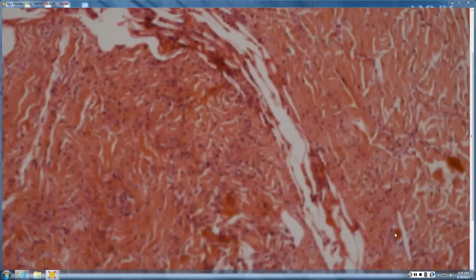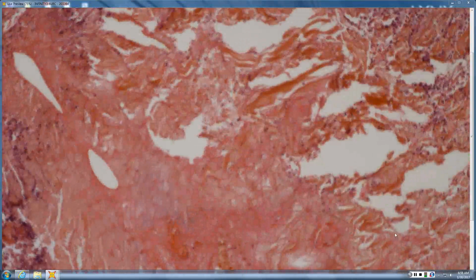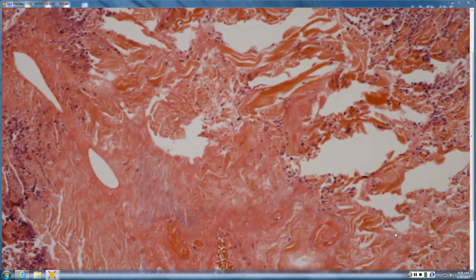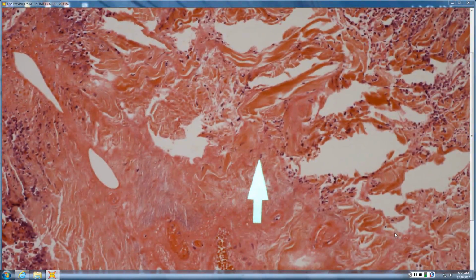And let me find, there's a cut over here. Let's see, where's that at? Here, you can start to see that when you get this sort of homogeneous pink look down here in this deep dermis area, all that's just necrosis. And so it just doesn't look right. It's got this sort of smudgy appearance to it instead of the nice, well-organized collagen bundles.